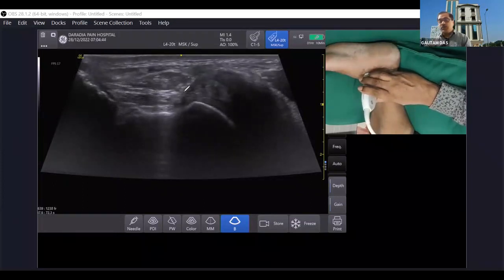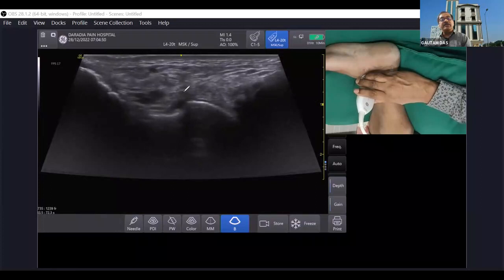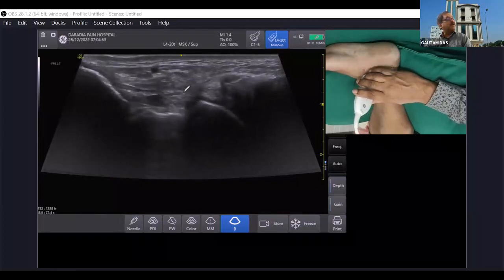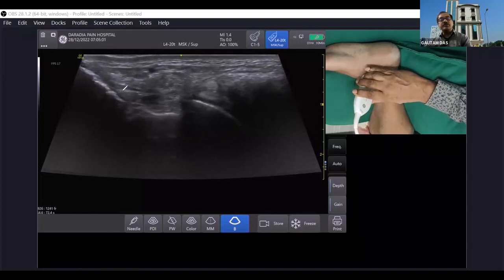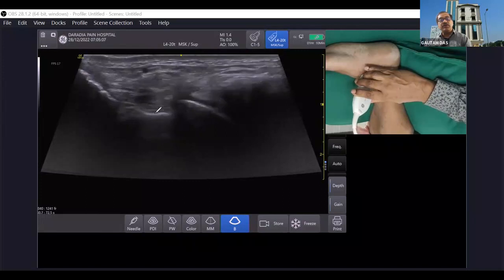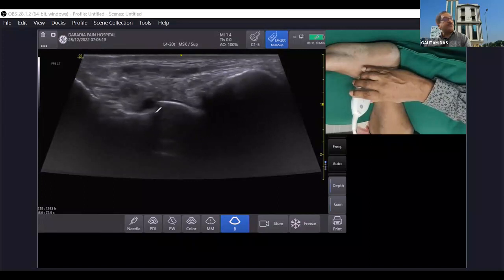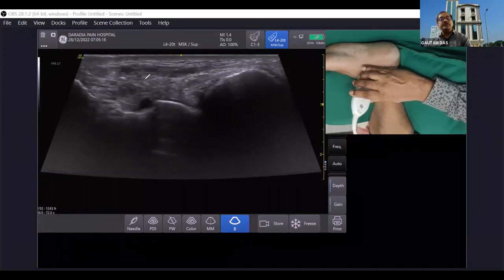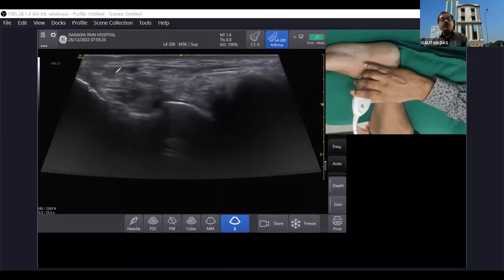Moving more anteriorly, two things appear: the anterior tibio-talar ligament becomes visible. Rotating the probe further, you can see the anterior tibio-talar ligament with its superficial and deep parts. Moving a little more, the navicular bone appears, and at this position you can see the tibio-navicular ligament clearly.